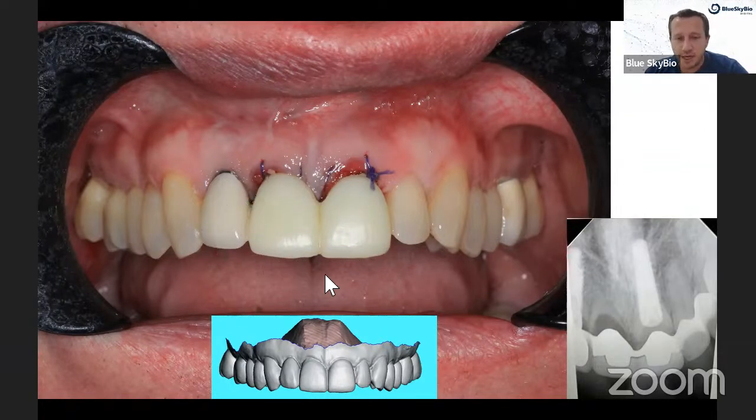But definitely everything in BlueSkyPlan, whether you're creating surgical guides or dentures or aligners or crowns, could be exported. Crowns could actually be exported for free. And a lot of the model editing tools functionality could be exported for free. But everything's exportable. When you're exporting something that was generated, such as a surgical guide or aligner, then those have the export fee, but you could buy the export credits, and only when you're exporting does it hit an export credit and deduct it. Otherwise, you could use a lot of the functionality in BlueSkyPlan for free. But again, to get it out of the software to STL or OBJ, that's where we have the paywall, but it's a very reasonable fee.